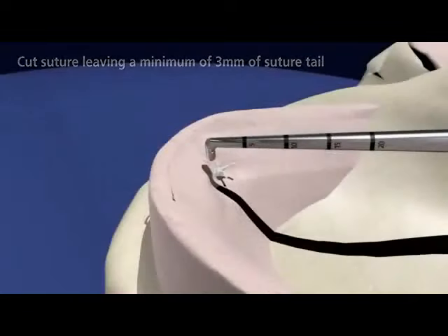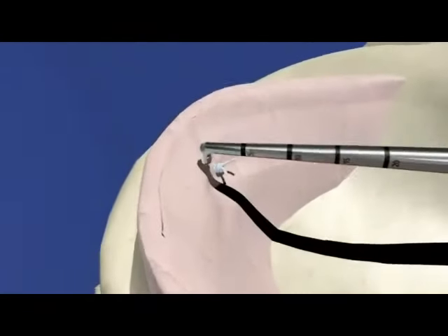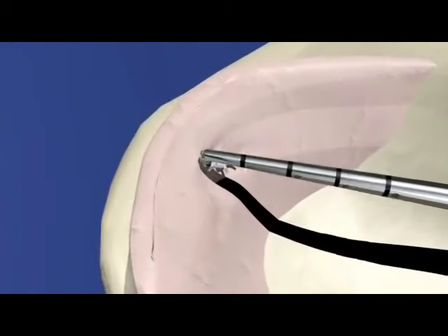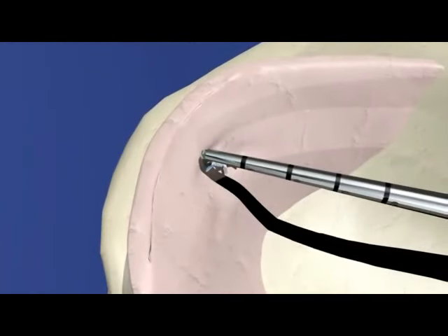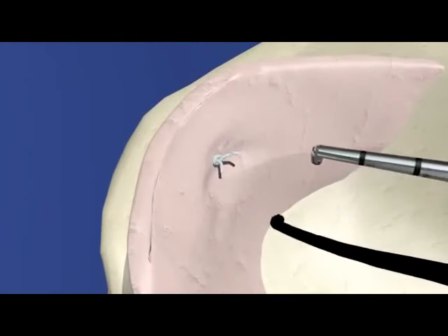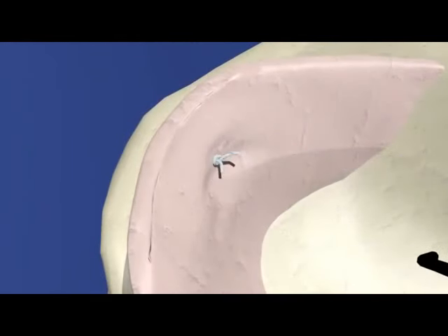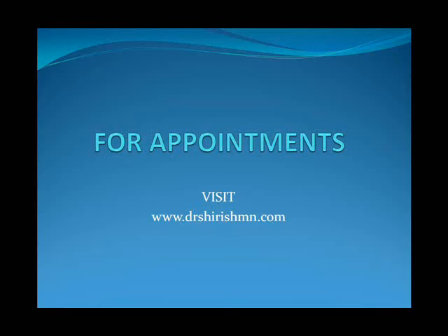Using the AS meniscal depth probe, assess the repair and examine and test. If necessary, additional AS meniscal repair devices can be used.